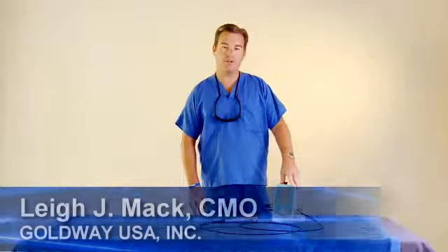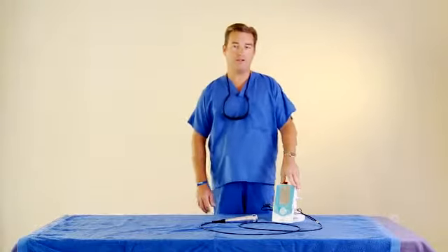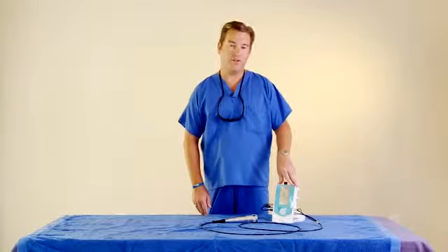Today we're going to talk about the Trio laser. It's a 10-watt class 4 therapy laser, but it also does soft tissue dentistry and light surgery. Today we're specifically going to talk about the therapy aspects of the Trio laser.